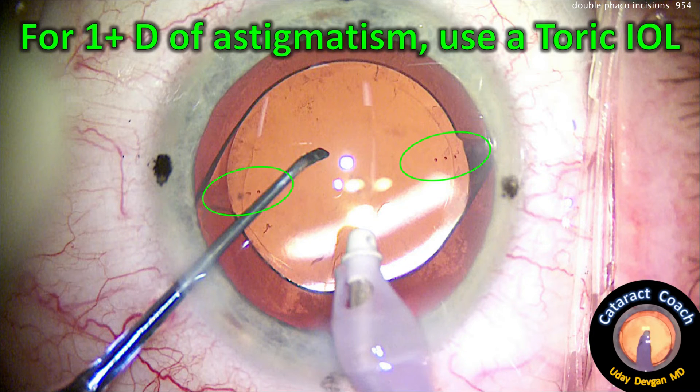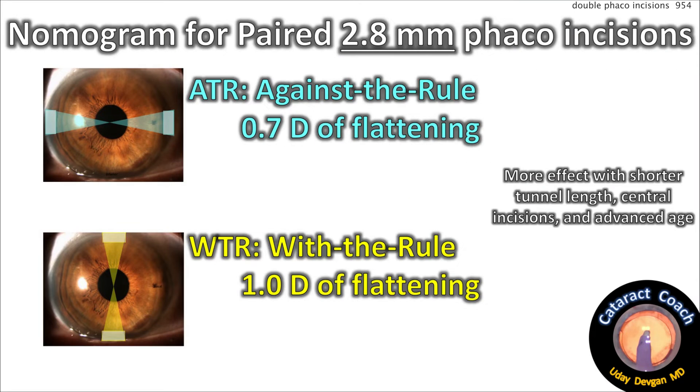For 0.75 diopters, as in this case, the incisional approach makes a lot more sense. Our nomogram for paired 2.8-millimeter incisions: against-the-rule paired incisions cause about 0.7 diopters of flattening on average, and with-the-rule incisions cause about one diopter of flattening.